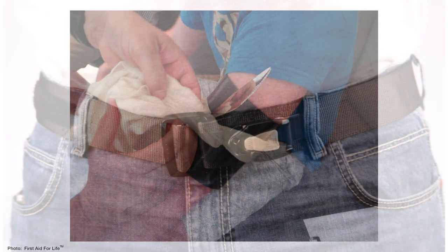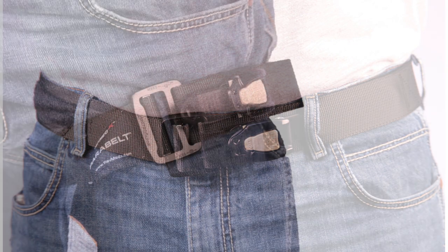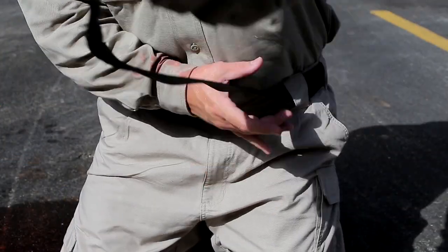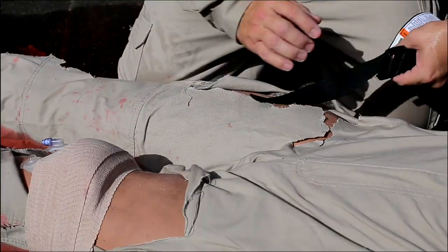But most people do wear a belt. That's why we developed Parabelt, a daily wear belt integrated with the ratcheting tourniquet. While Parabelt is not intended to replace a tourniquet in your medical kit, it does provide immediate access to a medical grade tourniquet anytime, anywhere.